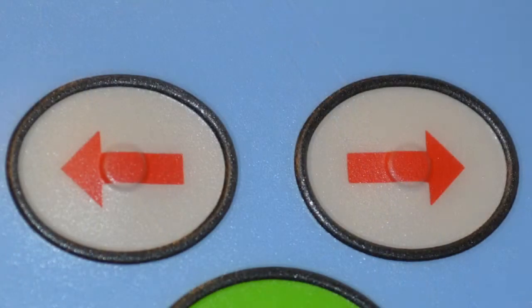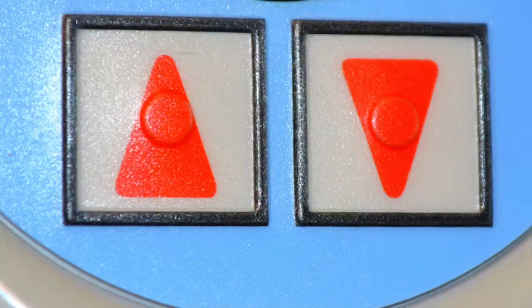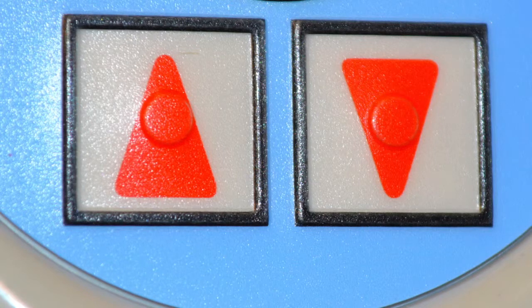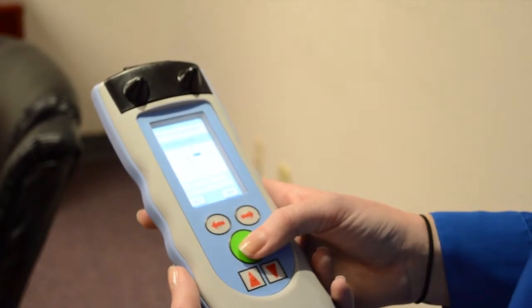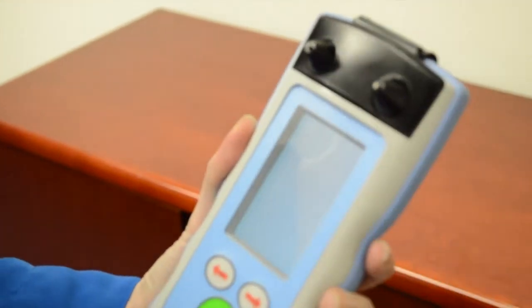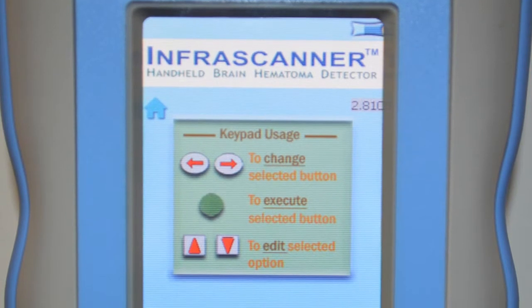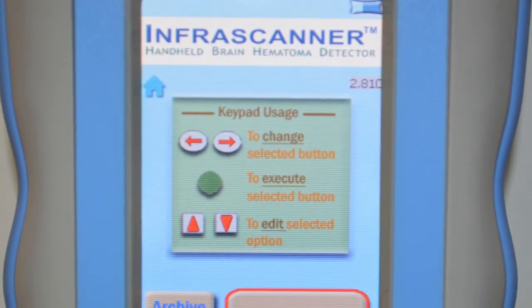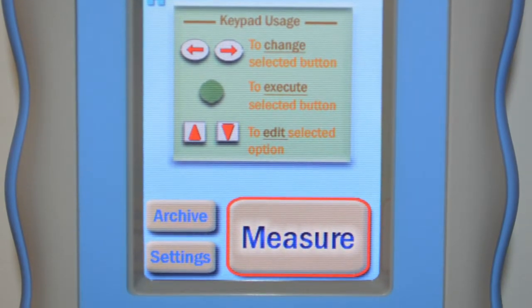The top left and right arrow keys navigate you through the InfraScanner screen menus. The center round green button is used to select or execute a task. The two up/down arrow keys are used to edit a task — for example, when navigating back to a measurement point to re-scan or navigating through the archive screen. When you power on, the first screen is the home screen, showing the battery indicator icon in the top right, a keypad usage diagram in the middle, and measure, archive, and settings choices at the bottom.